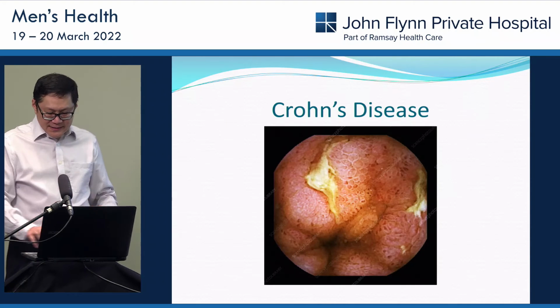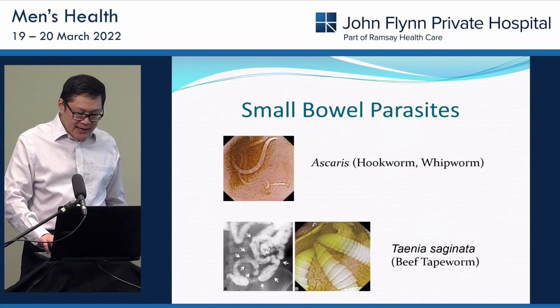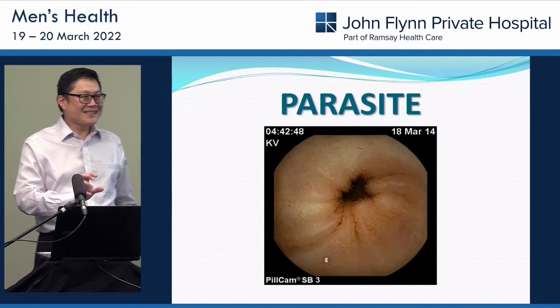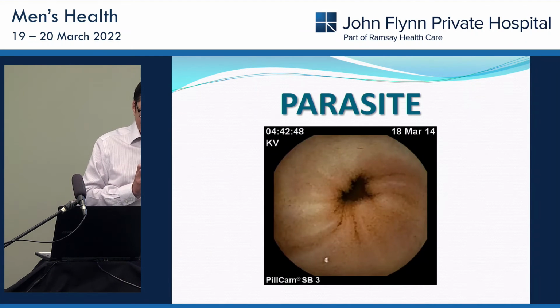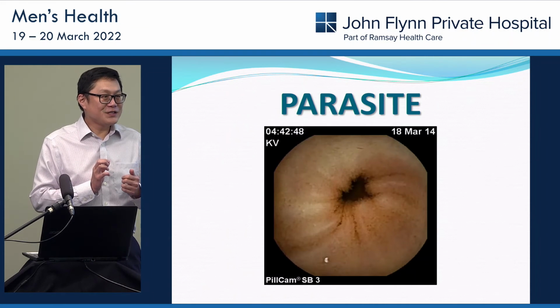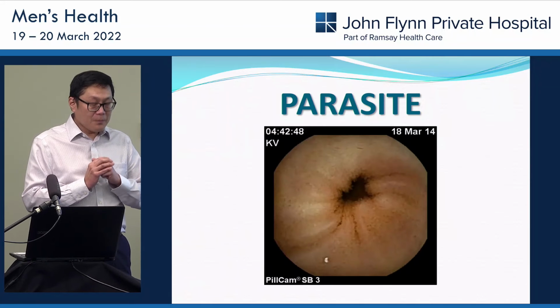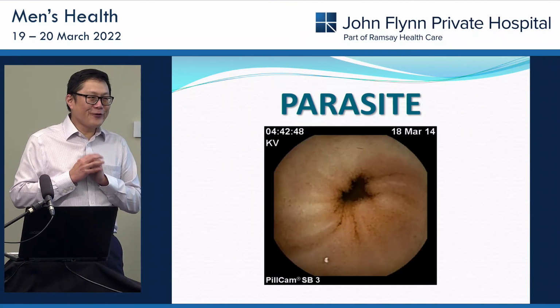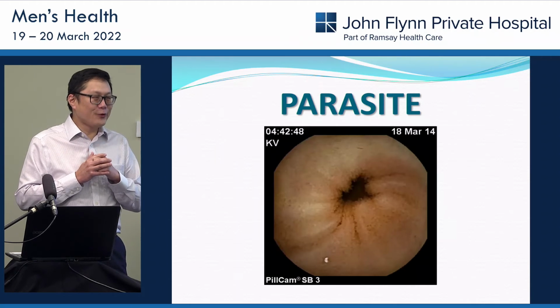Okay, so other things we might see: Crohn's disease with the serpiginous ulcers, parasites, and I'll end my talk with a nice video of a parasite. Okay, so this was recorded in a middle-aged man who started to develop recurrent iron deficiency and intermittent melena after returning from a trip to Cambodia. Now he recalls accidentally swallowing some contaminated water from the Mekong River during a boat ride.